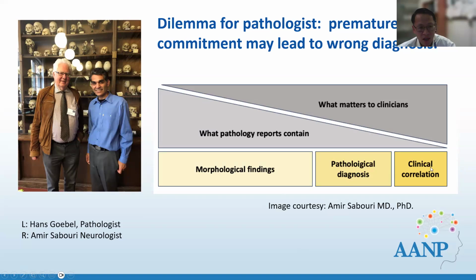And then you can write a comment paragraph which talks about clinical correlation. This is where you give your impression. You think about what the possible etiology is, but you don't give 100% certainty as you give for the pathologic diagnosis. What matters to us the most as pathologists is that we want to ensure these to be correct. And what matters most to the clinicians are actually the clinical correlation parts. That's what we truly think about.